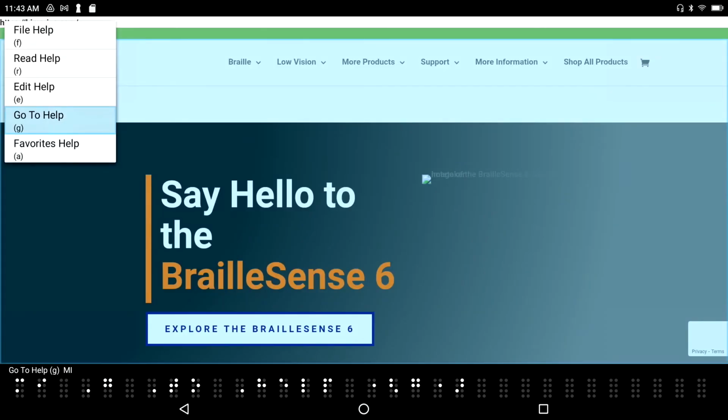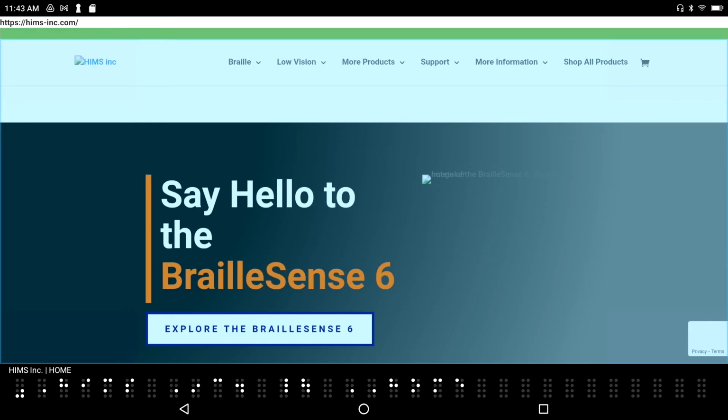Help closed. Go to help. I would encourage you to read the manual, which is found off of the main menu under Help, like we showed you earlier. HIMS Incorporated, home. And if you ever want to revisit the Quick Start Guide, you can do so under the Settings menu.